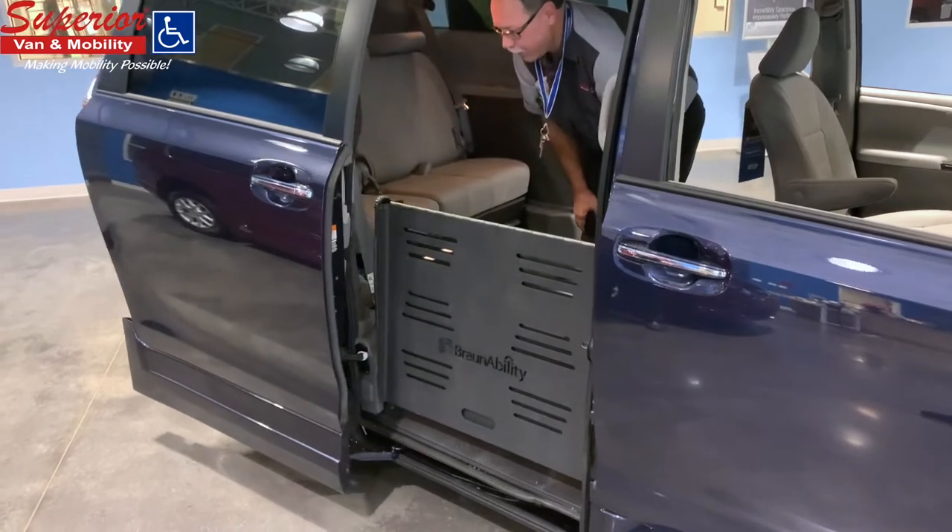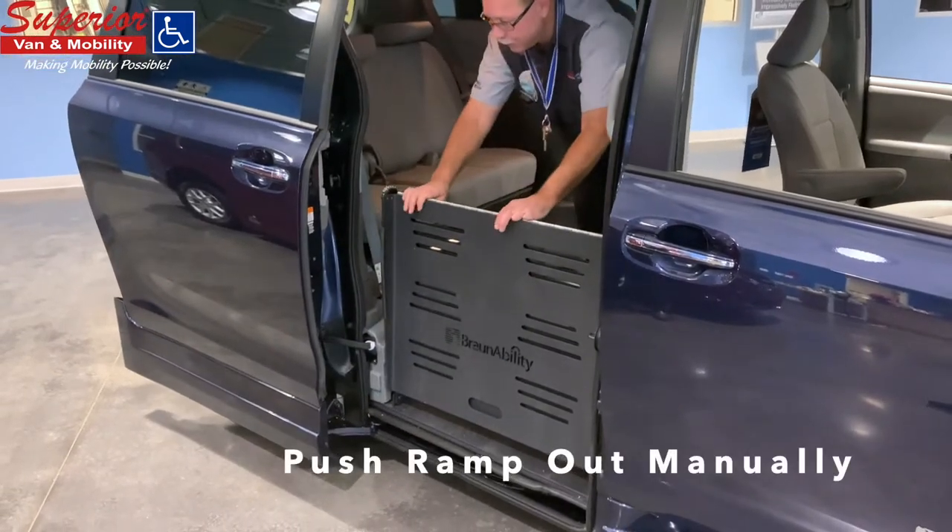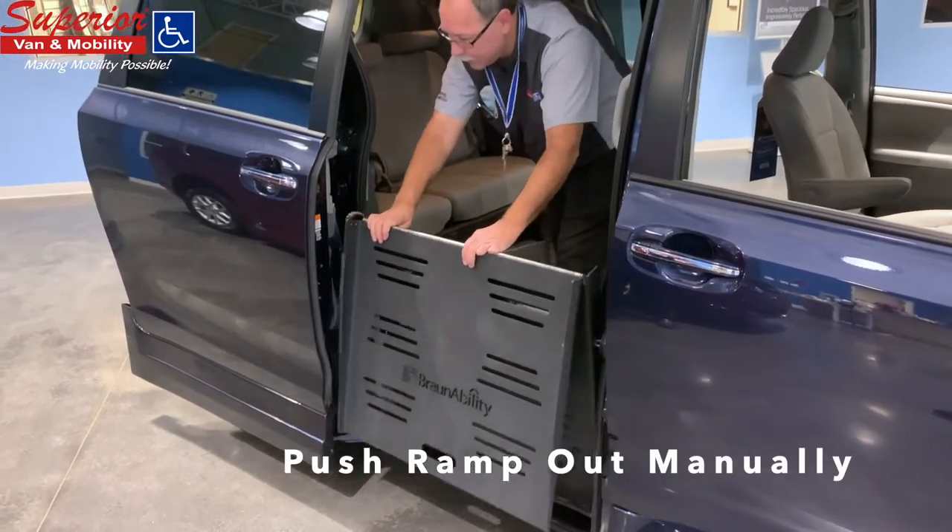To deploy the ramp manually, simply open the door and slowly push or pull the ramp out.